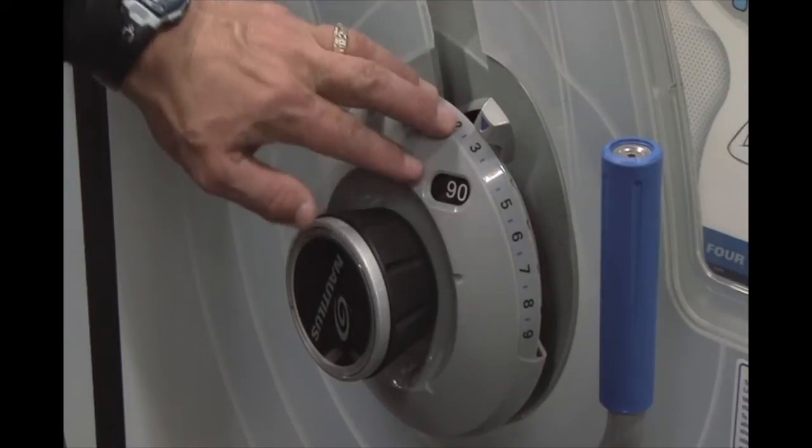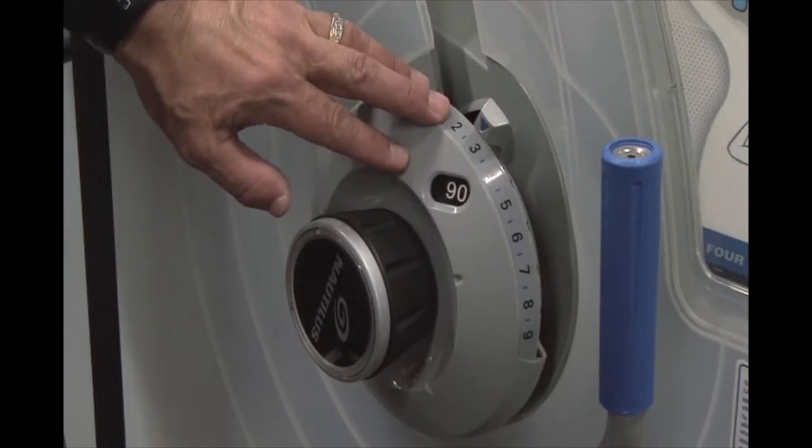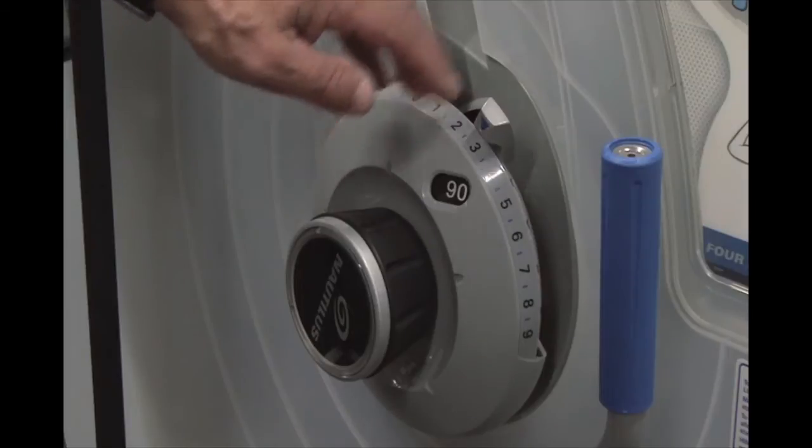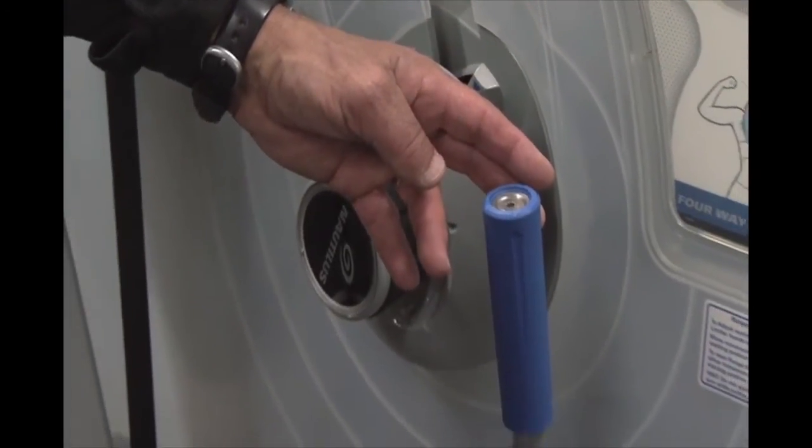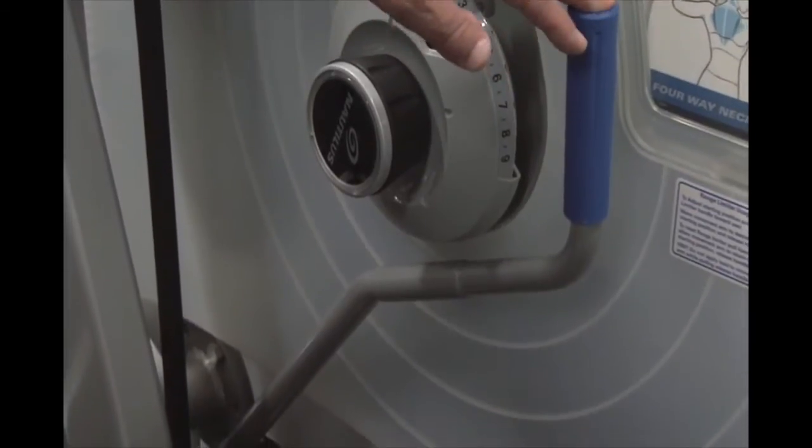In addition to having the 1-pound increment adjustments on all but the leg press, we also have the option of start point goniometric range of motion limits on all the Nautilus One products.